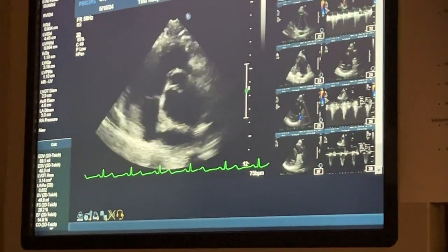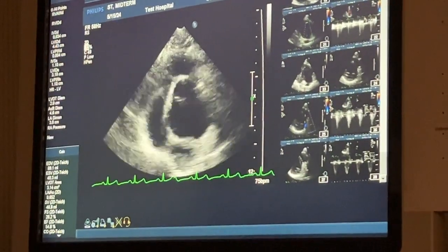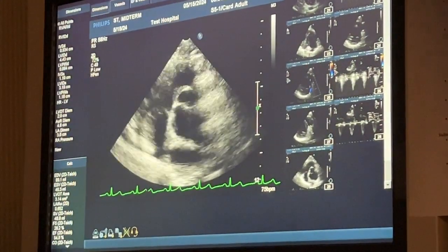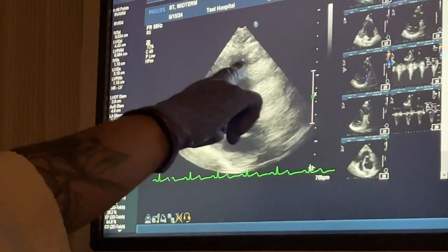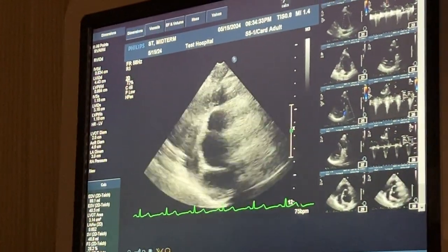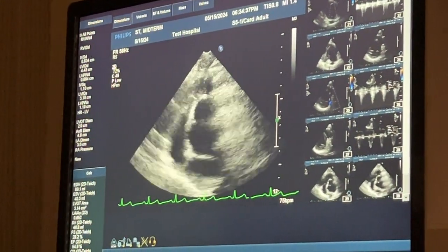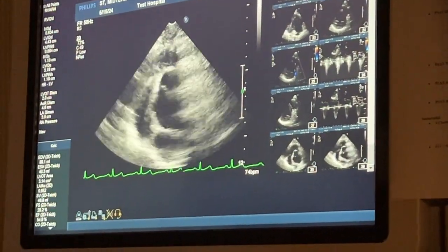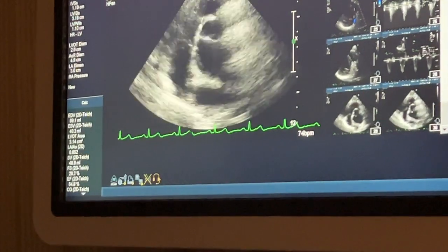And then hold it right there for just a little bit for me. Okay, breathe. So I was telling you guys this. Some of you were struggling with your RVOT view from parasternal long, and you would also notice that same shadowing for your RVOT. You can expect, when you're in the same window, even when you rotate your indicator, you're going to have the same problems as you did in the other view. So it's just going to be kind of hard in hiding, but that is okay.